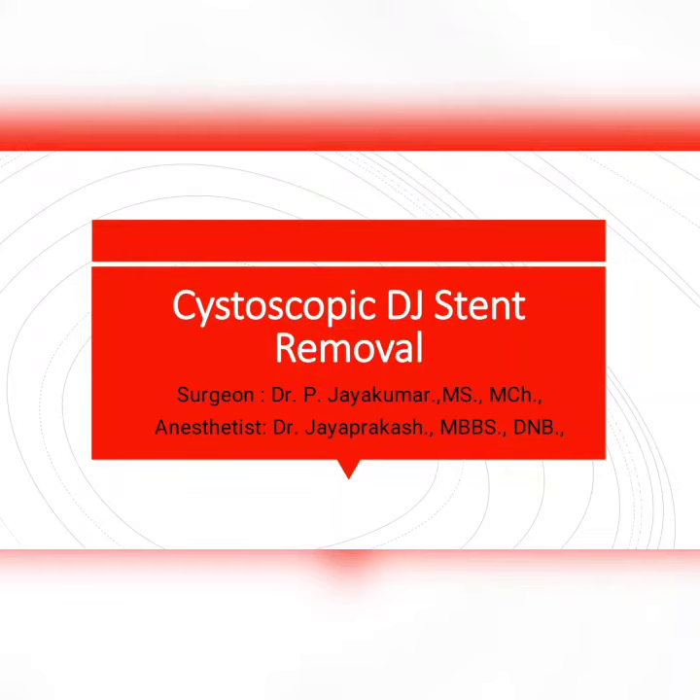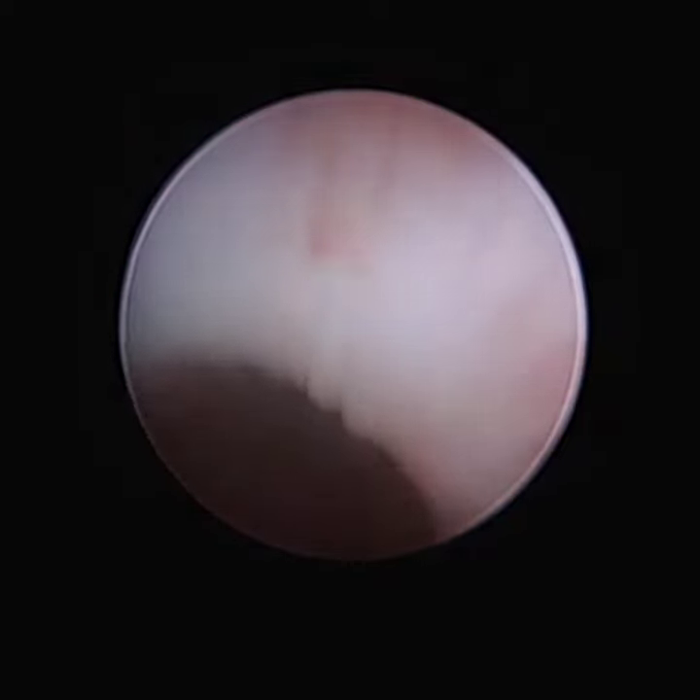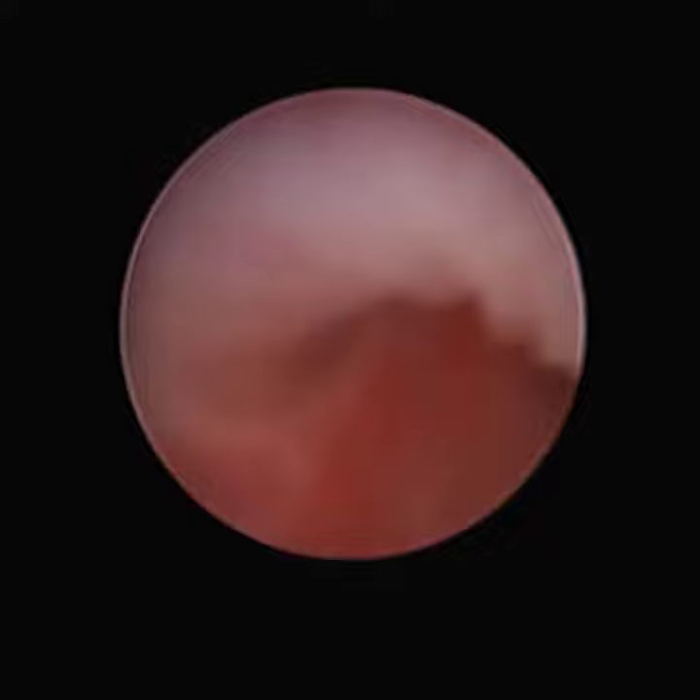This unedited video is a case of cystoscopic DJ stent removal in a 5-month-old child who was operated at 3 months of age for PUJ obstruction. A 4.5 French cystoscopy was done, with the anterior urethra and posterior urethra entered.